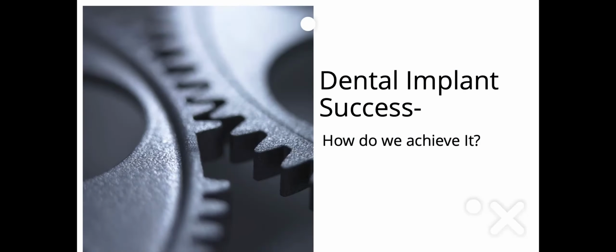So, first of all, sometimes it can be pretty vague. What is success? And sometimes we can be hard on ourselves in determining when our cases are successful. But in a nutshell, from what I've experienced in the past with dental implants, no news is good news. So when the patient is happy and their function is restored, and then there's osseointegration, those are the basic elements for determining when you have dental implant success.